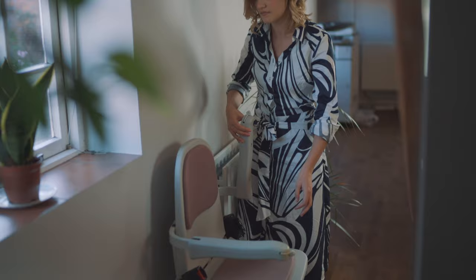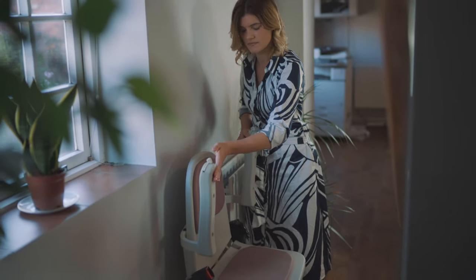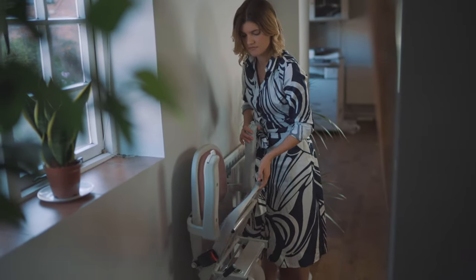In this video demonstration, we are going to show you how to store a stairlift when it's not in use. Stairlifts have foldable components which make them compact and easy to store on the staircase.